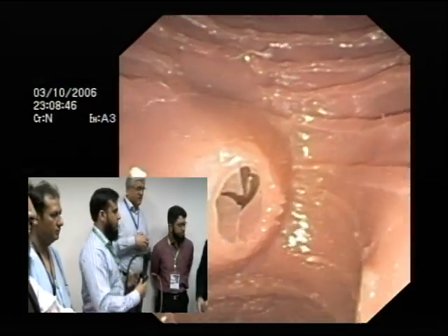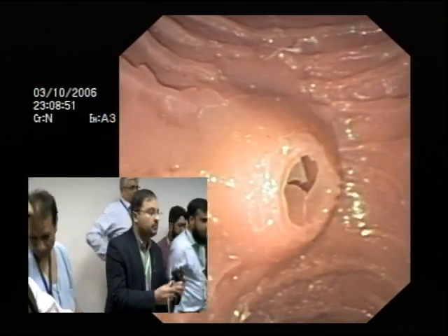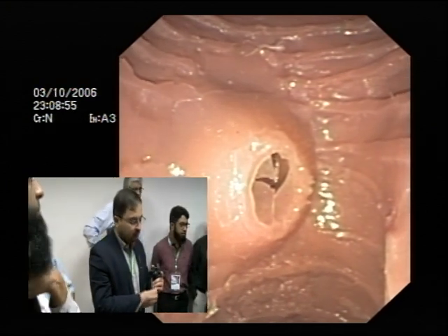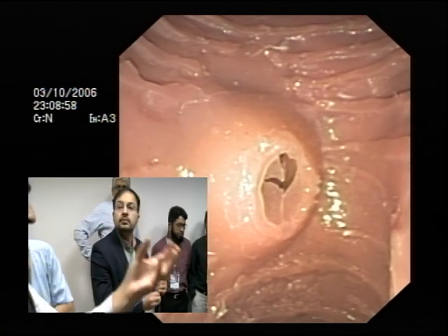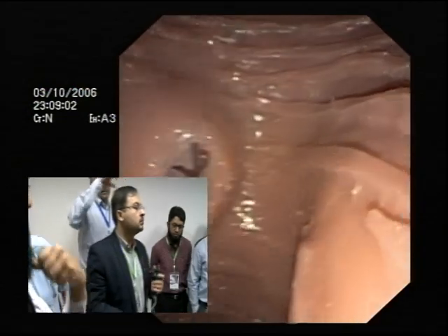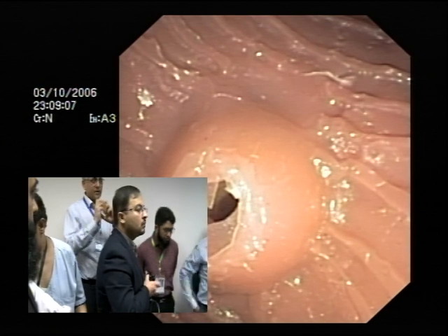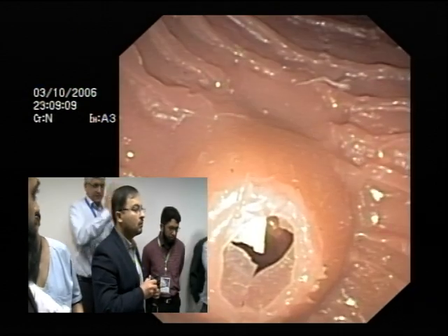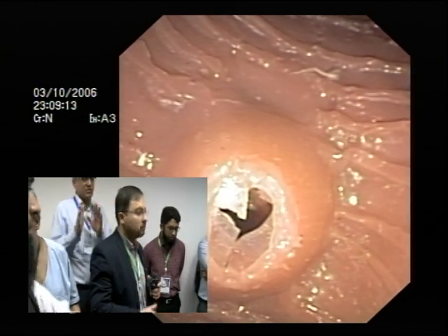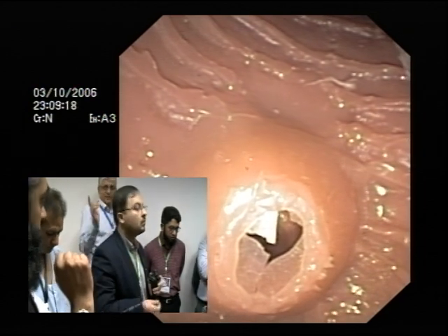Who's next? Have a look and we'll... Buzz in whatever you want to say, GVS. Yeah. Obviously, this is about right-left, use of right-left wheel, big wheel, use of... This is all this is. It makes no difference whether you can cannulate or not cannulate in this one. But normally, like Dr. was saying, the ampullas can be different. Okay.